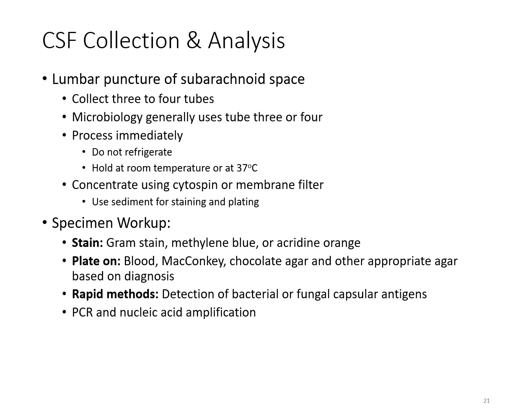But anytime a spinal fluid is sent to the lab, it is considered a stat because that's not a sample that's easy to collect. You do not want to put somebody through a spinal tap multiple times. It's not fun, it's not easy on the patient, and it runs a lot of risk. So a spinal tap should only be done when you really suspect that that's where the issue lies. And then once you get that, it is a stat test. So you're pretty much going to stop what you're doing to process your spinal fluid.